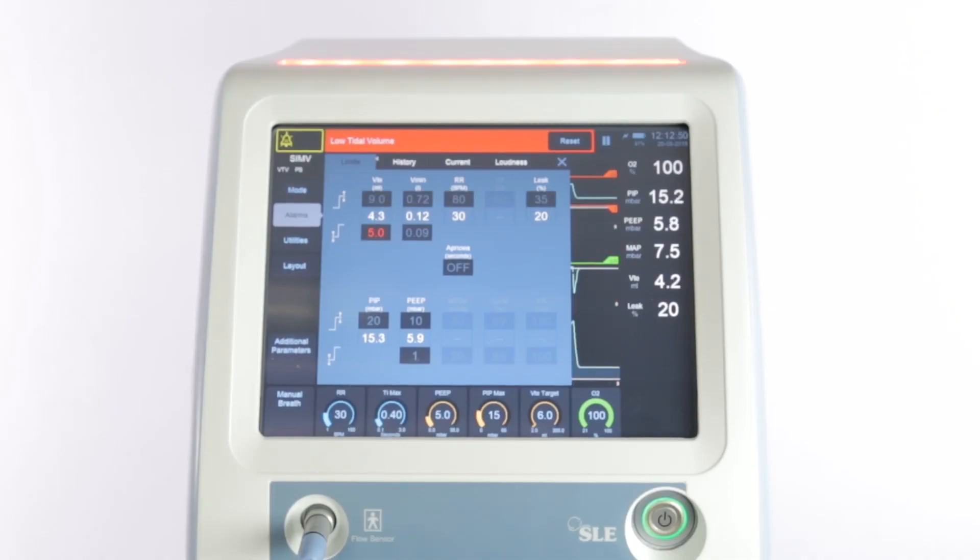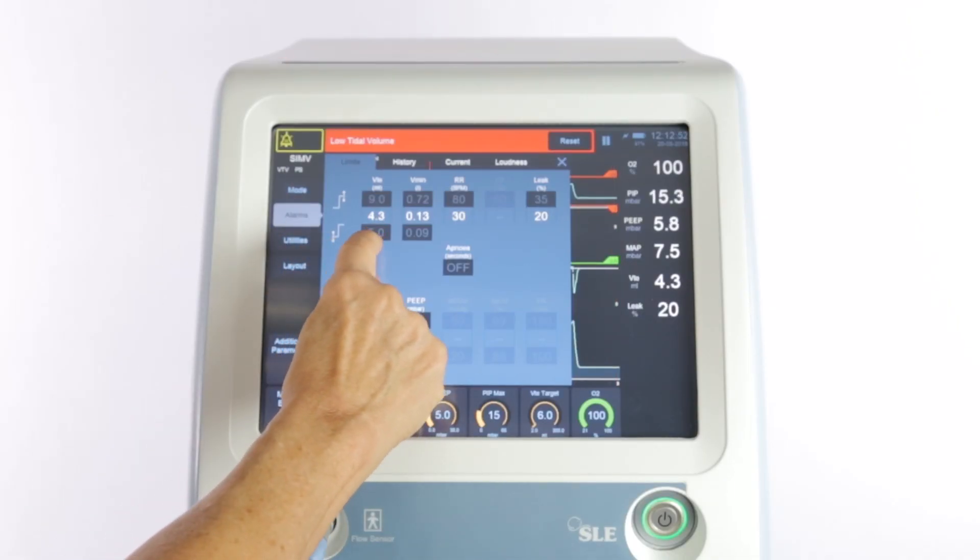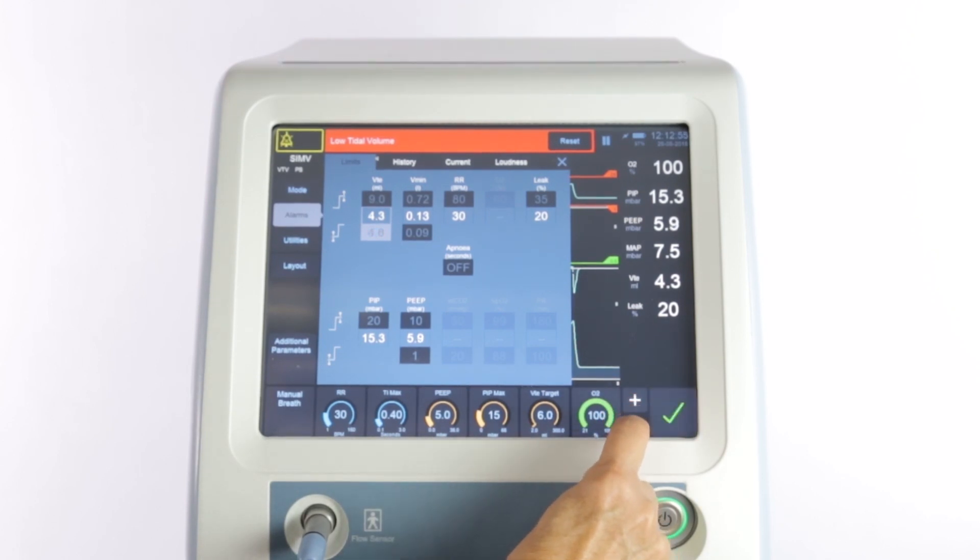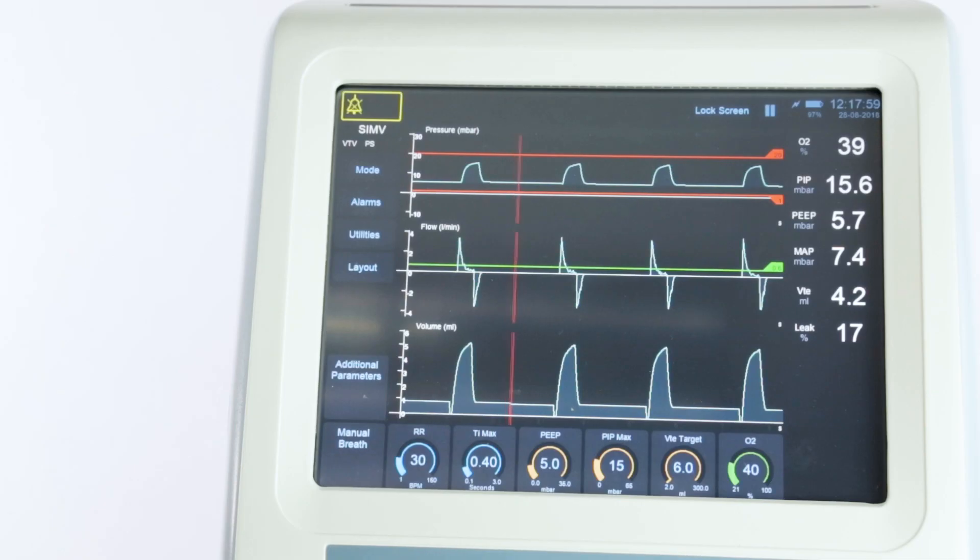Making changes to the alarms is a simple matter of selecting the alarming limit, then once the adjustment buttons appear, modifying it to stop the alarm. Then either press Confirm to accept or the Cross or Alarms button to cancel.